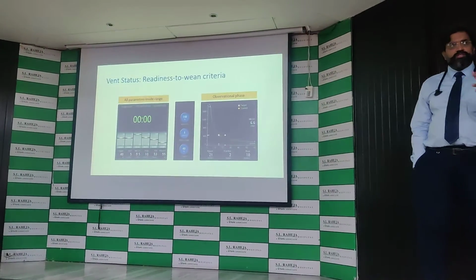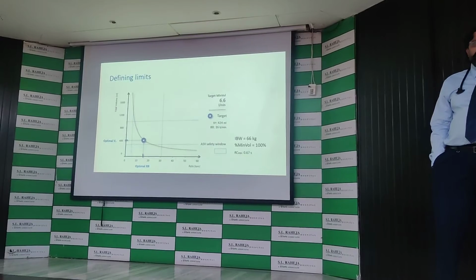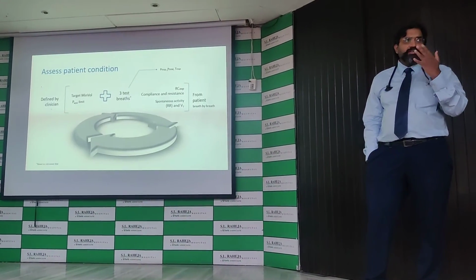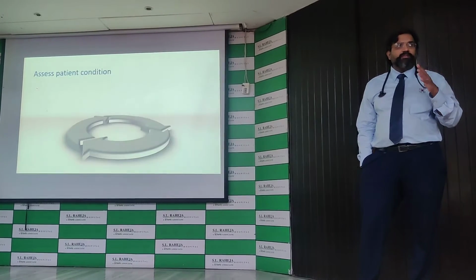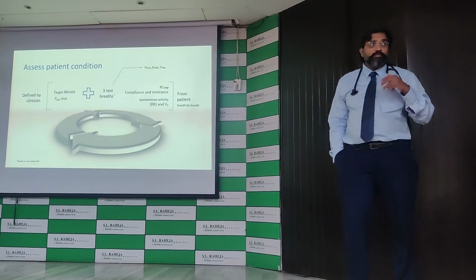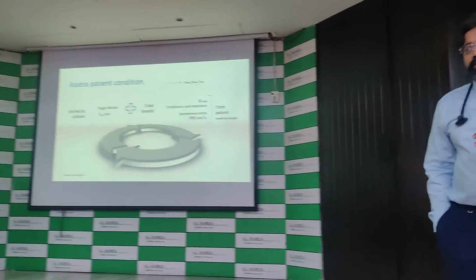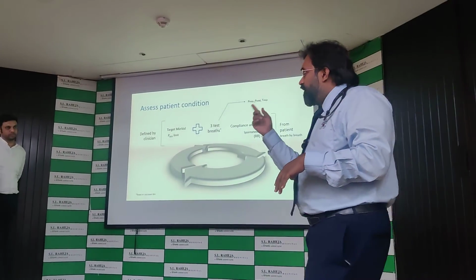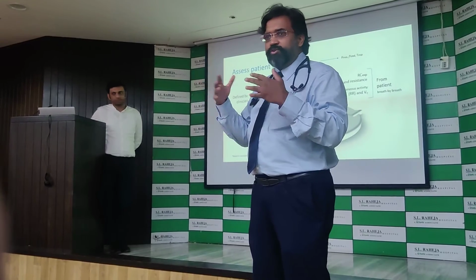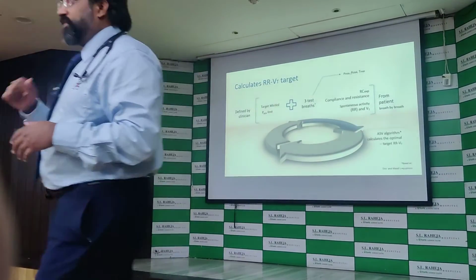One of the problems of this is that it gives high RRs, and the I:E ratio is completely dependent on the time constant. That makes it a little bit difficult because very often you get 1:1 breaths on ASV, which is kind of an inverse ratio. Very often you get punished by the time constant, because the time constant of every lung is different. If you look at ASV next time, you get punished on almost all events.